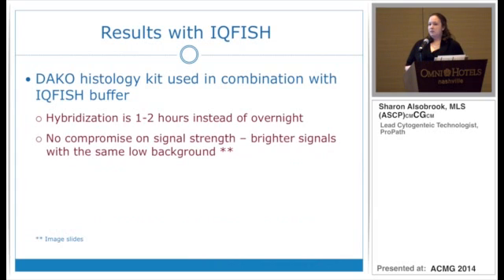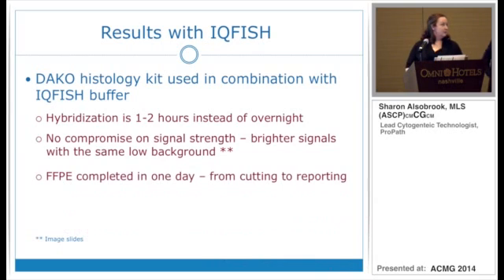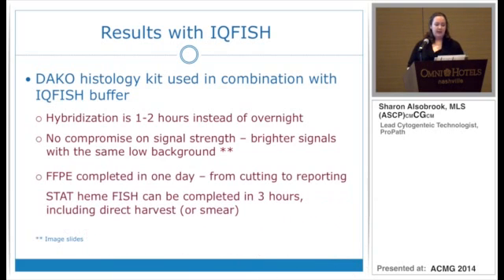And that sounds great, but the best thing was it didn't decrease the quality or performance of the probe. If anything, it improved the quality and performance of the probe, including any background. So aside from the turnaround time, hybridization time aspect, just the quality of the assay was improved. That means we can complete everything in just 1 day, including any stat hematological FISH assays such as PML RARA.